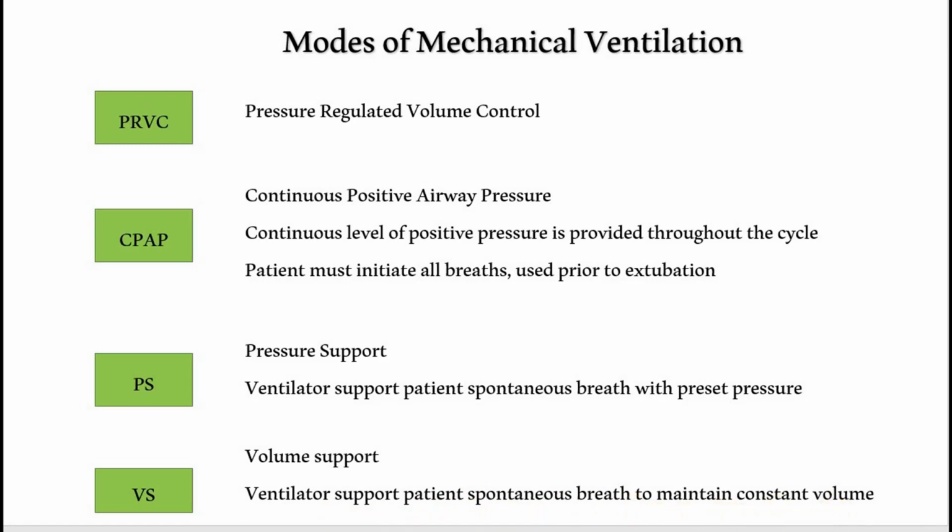At times, combination modes are used. Example, SIMV with pressure support or SIMV with volume support. And it all depends upon the patient's condition.